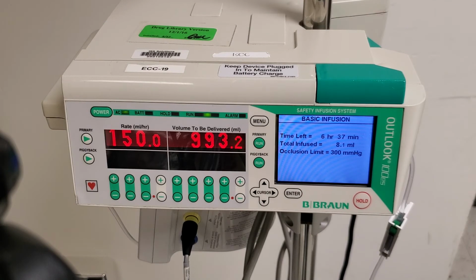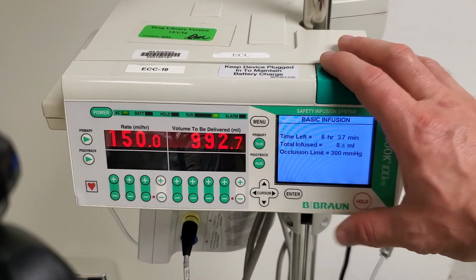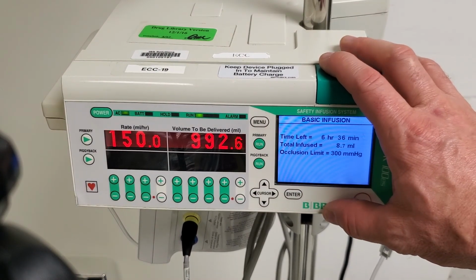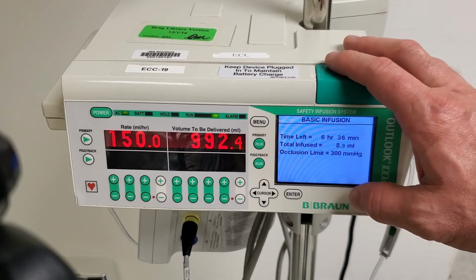We covered basic infusion. We covered a calculated drug infusion from the library. And we covered running a piggyback. Remember that you must set the numbers correctly in the pump. Double check your entries because if you don't enter the numbers correctly, the pump won't deliver the right dosage.